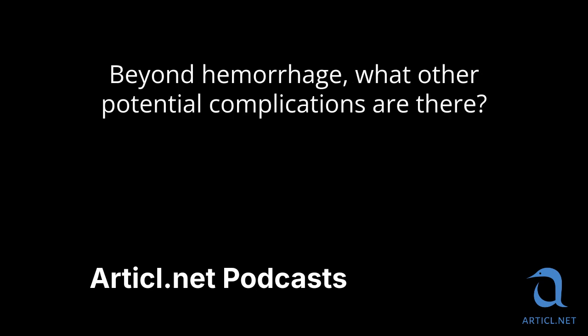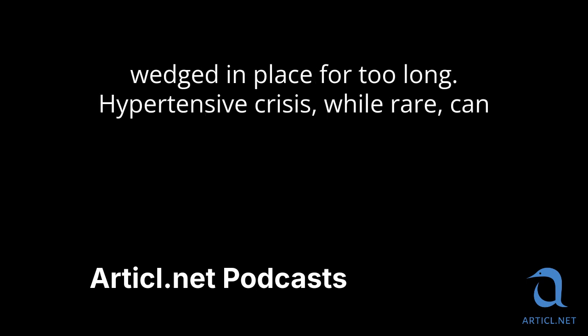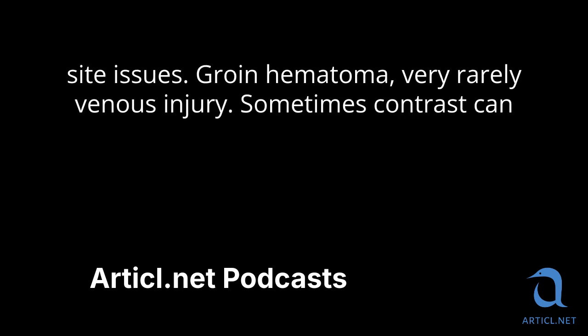Beyond hemorrhage, what other potential complications are there? You can get adrenal vein thrombosis or perforation, especially if a catheter is left wedged in place for too long. Hypertensive crisis, while rare, can happen. Adrenal insufficiency, as we mentioned. And then the usual access site issues, groin hematoma, very rarely venous injury. Sometimes contrast can leak out, causing discomfort, but usually no major hematoma.